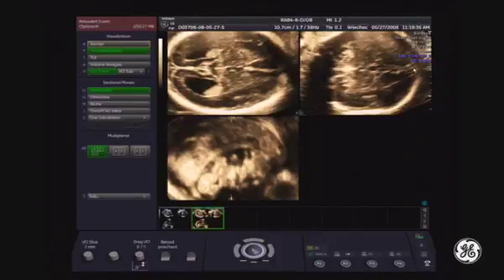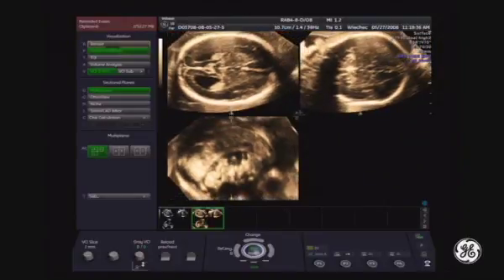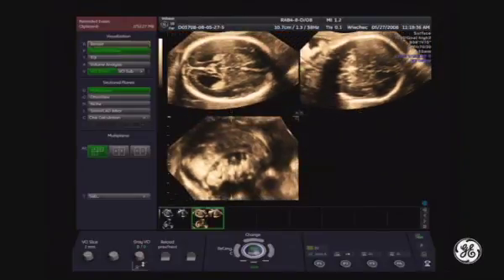So instead of one line in a normal brain, where two hemispheres are adjacent one to another, here you have this separated view. You can also review the A plane, because the separation can be demonstrated there. I will reduce the magnification. I will select the A plane, and I will initiate tomographic imaging.